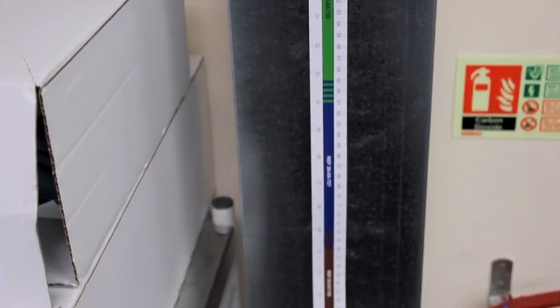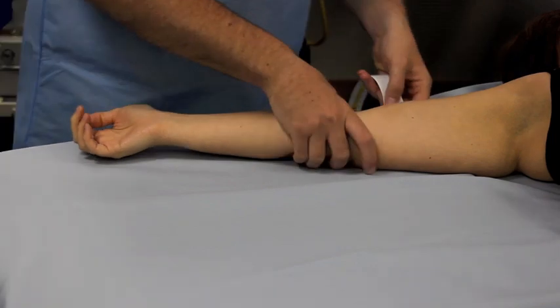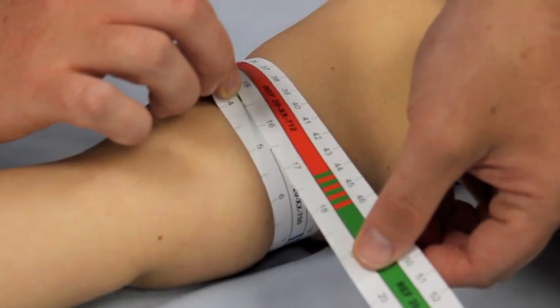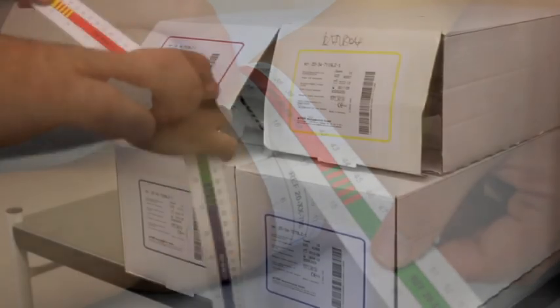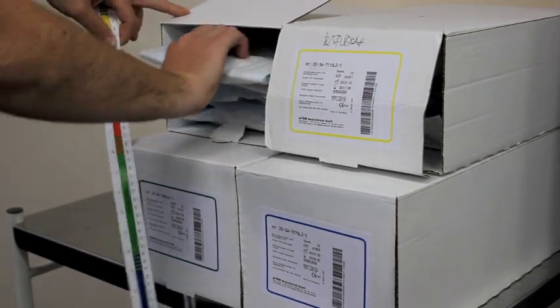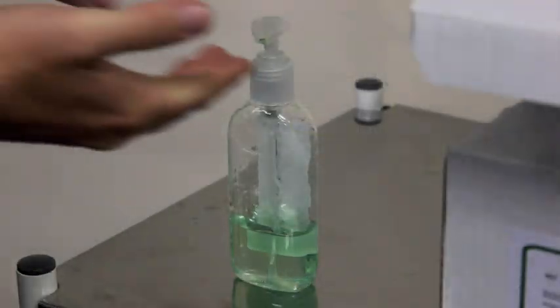The VBM colour coding system and tape measure facilitate ease of selection. The limb should be measured at the widest point. VBM offer a variety of shapes and sizes, varying from paediatric to bariatric, including the conical thigh calf.